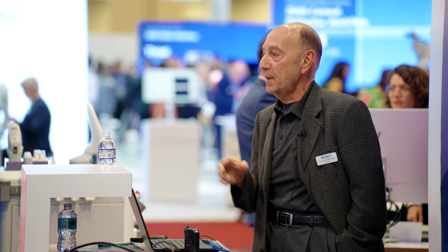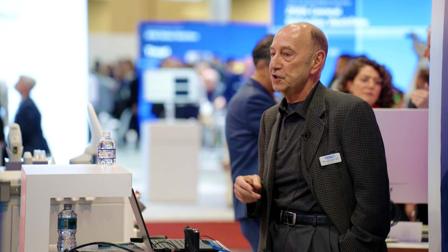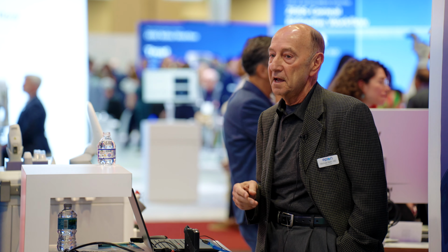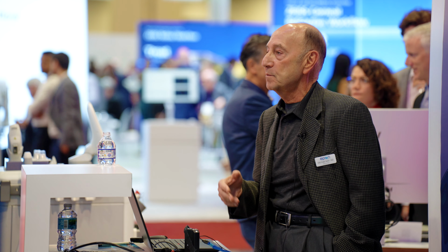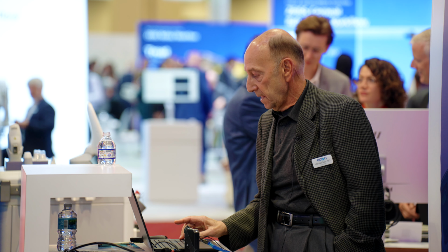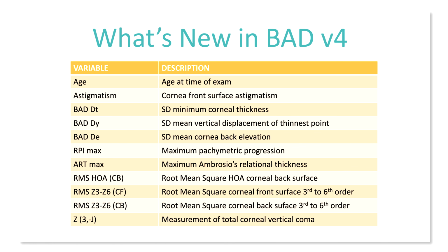So you can imagine I could have had a Placido of 1 circle and put 1,000,000 dots on it, it would be highly inaccurate, even though I have 1,000,000 data points. So a chain is only as strong as the weakest link, and we only needed to utilize 11 parameters. Anything more really did not help. And the parameters actually are very different. These are the 11 parameters utilized in version 4.